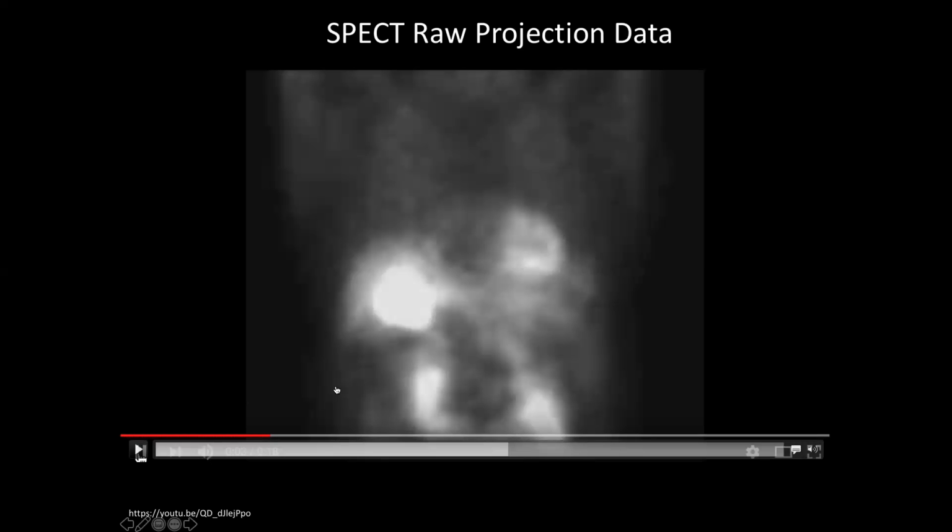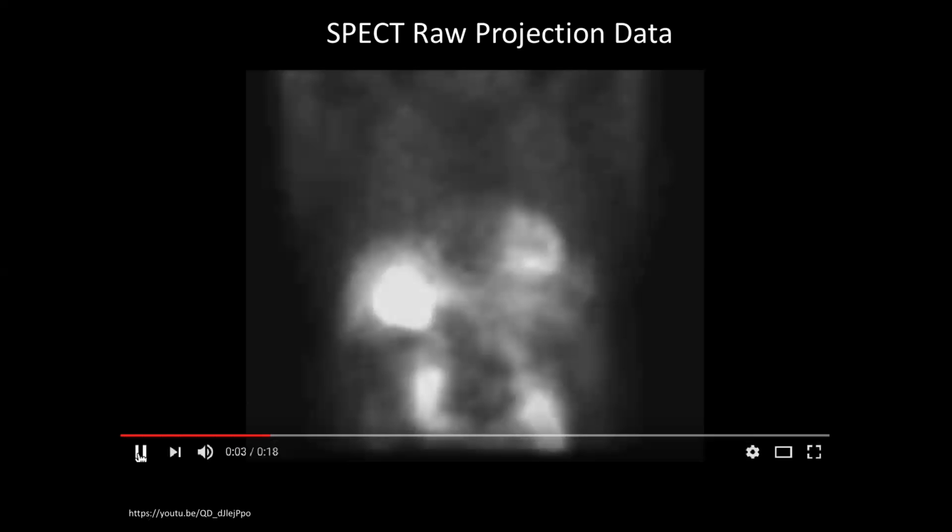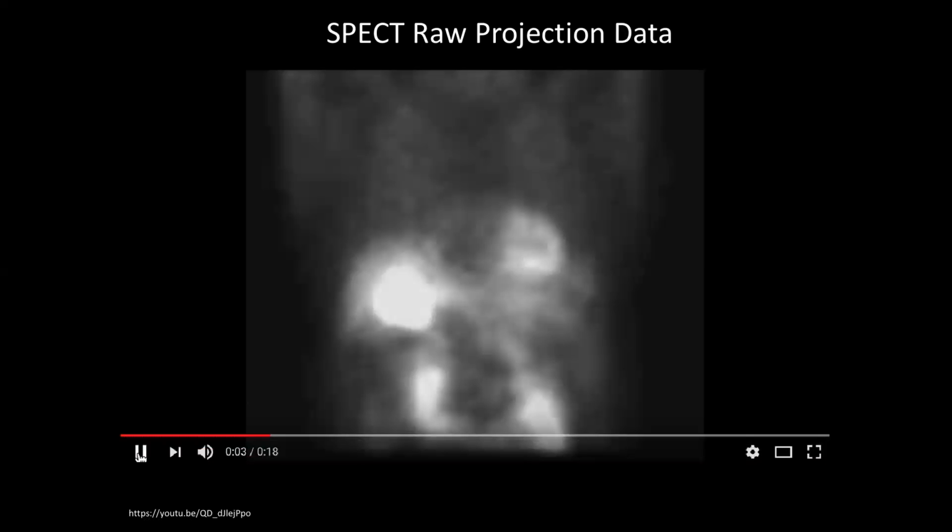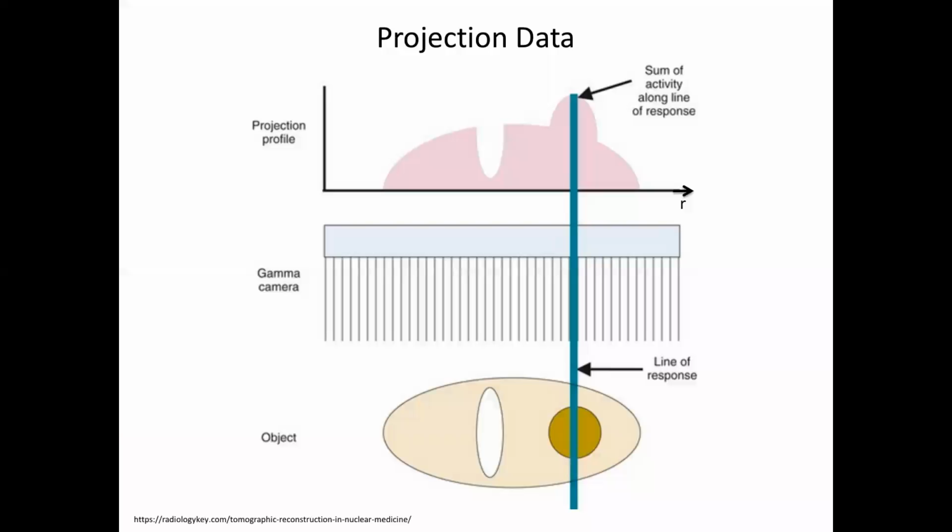Right? And so one view actually serves that function. If what you want to do is look at the relative brightness of different parts of the heart, then you pretty well have to do a three-dimensional reconstruction, because this is a confusing signal. I mean, it's the buildup of activation through a very large chunk of heart, right? So you want to isolate it more. Okay, so for each one of those angles, we get one of these views.